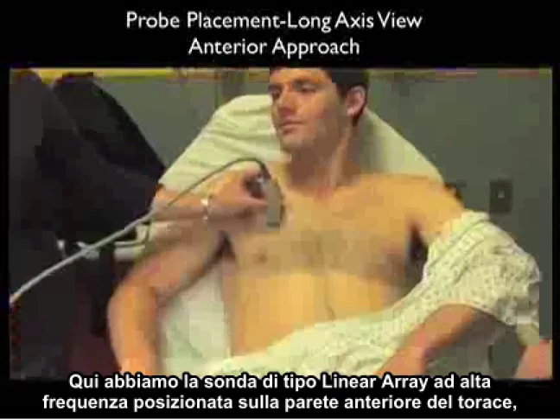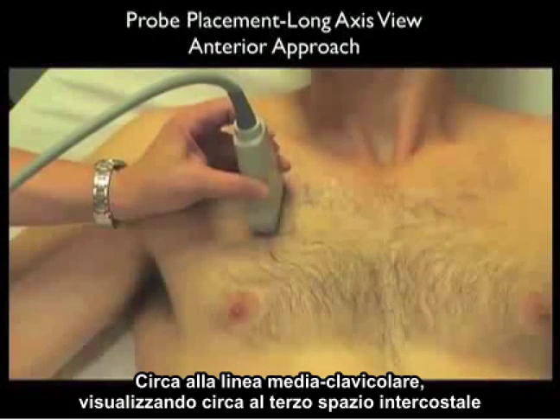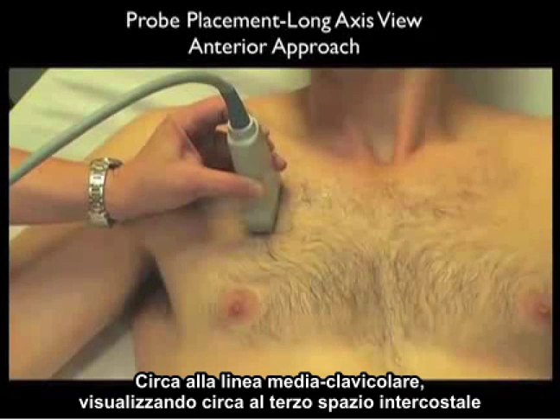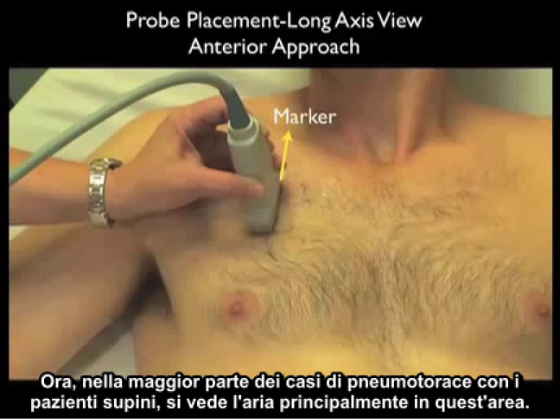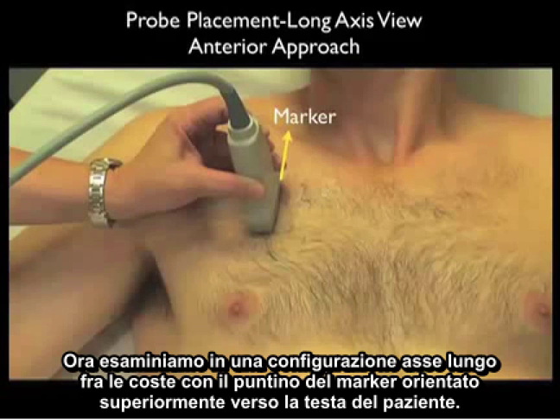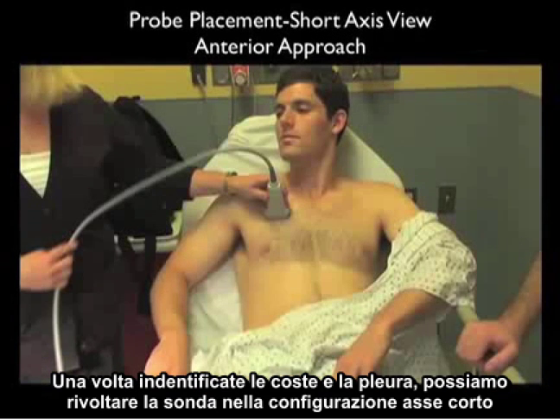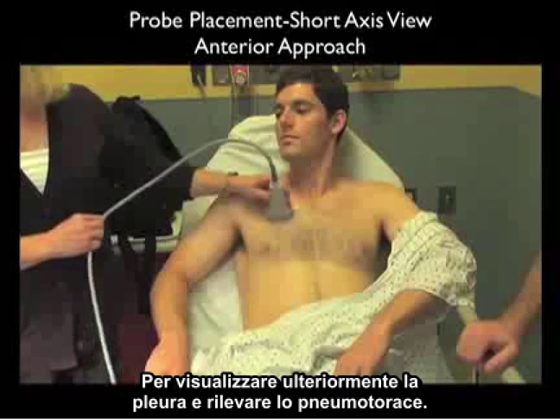Here we have the high-frequency linear type array probe positioned on the anterior chest wall at about the mid-clavicular line, looking into about intercostal space 3. In most cases of pneumothorax with the patient supine, the air would be predominantly seen in this area. We're looking in a long axis configuration between the ribs with the marker dot oriented superiorly towards the patient's head. Once we've identified both the ribs and the pleura, we can swivel the probe into the short axis configuration to further look at the pleura and detect pneumothorax.